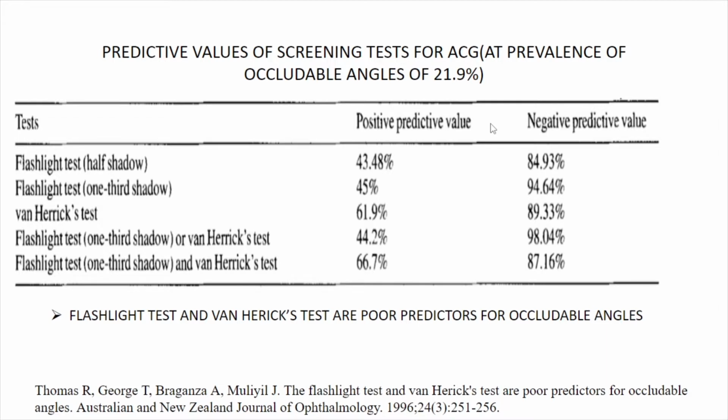So, what is a negative predictive value? Sir, it's the number of true negatives from the whole test negatives. It's the possibility that if the test comes out to be negative, that it actually is so. Basically, when you see a patient, you only know whether the test is positive or negative. So the negative predictive value tells you how likely that result is true. This is the information that we use in order to make a decision on who we gonioscope. A negative predictive value does not rule out angle closure, but you are willing to take the chance that 90% of the time you're not going to miss a narrow angle.